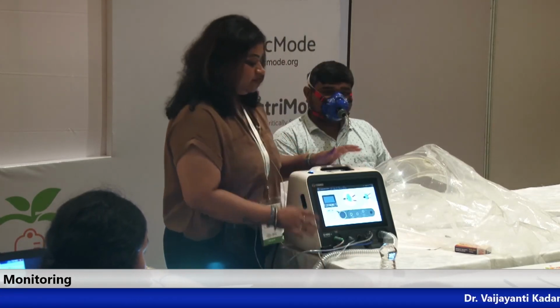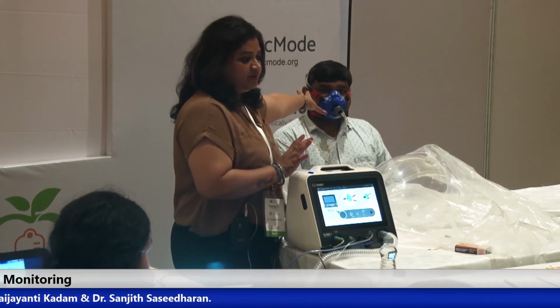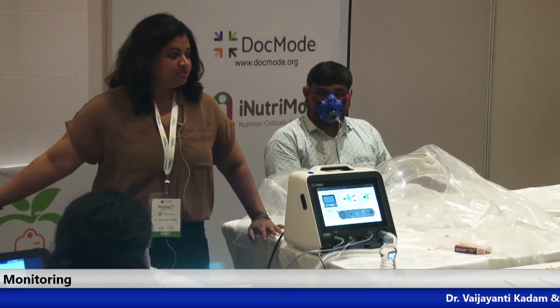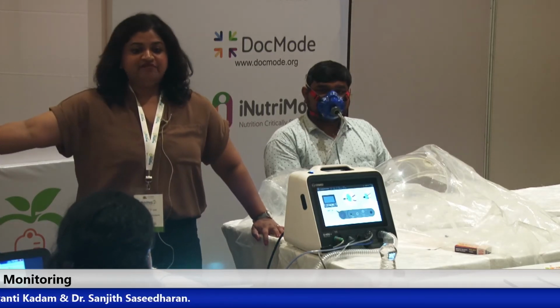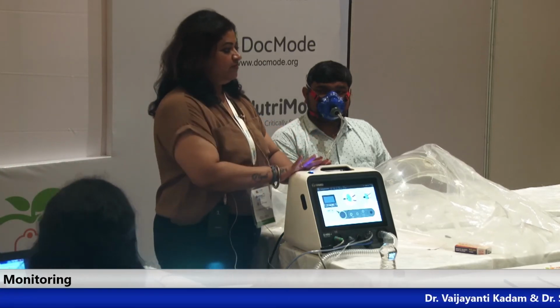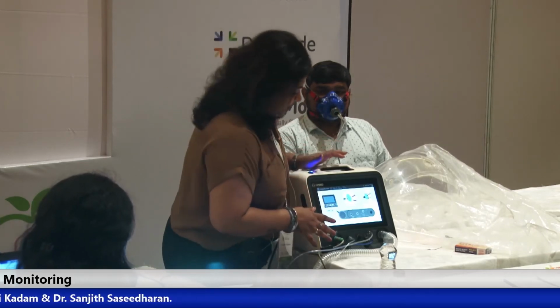Since these measurements are done inside the machine, the leaks over the interface do not matter at all. As against this one, which is going to tell us the dilutions of the gas exchanges in the lungs, it will get affected if there are leaks. But in this case it will not, because pressure is not being monitored, volume is being monitored. So every breath is going to give us the measured volume.